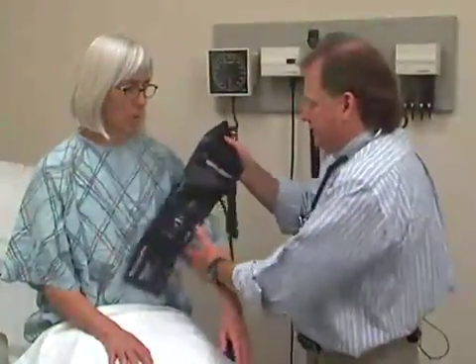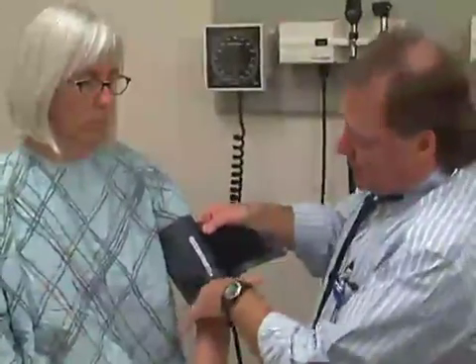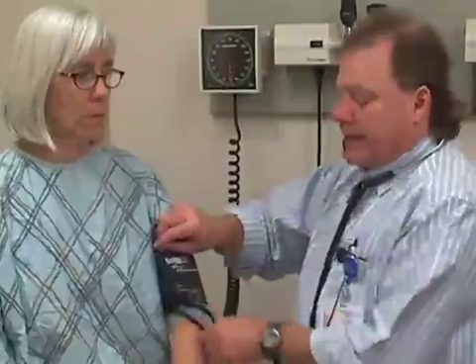Next we'll move into blood pressure. In this room we have a blood pressure cuff attached to the wall; sometimes you'll have a portable model. The first thing to assess is the size of the cuff to make sure it's appropriate for your patient. As you put it around the upper arm just above the crease of the elbow, check the markings — the artery marker must fall within the range shown, otherwise you may need to switch to a larger or smaller cuff.